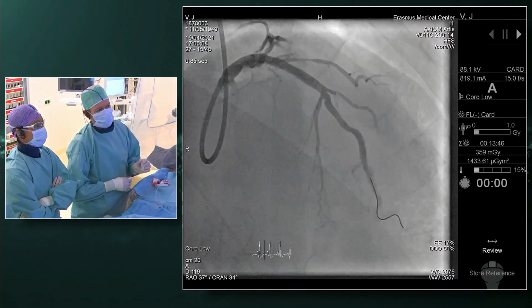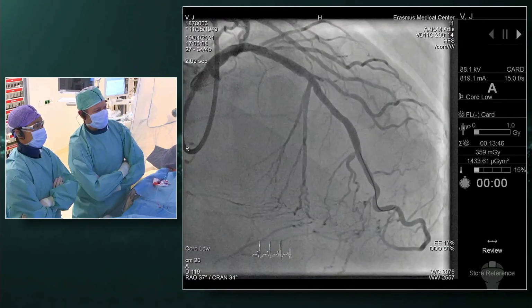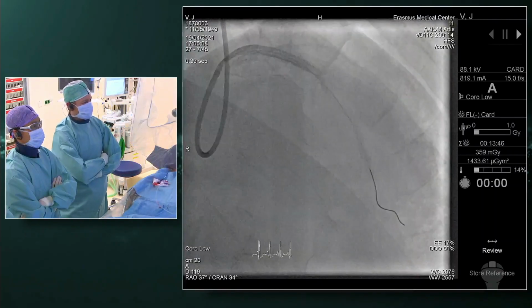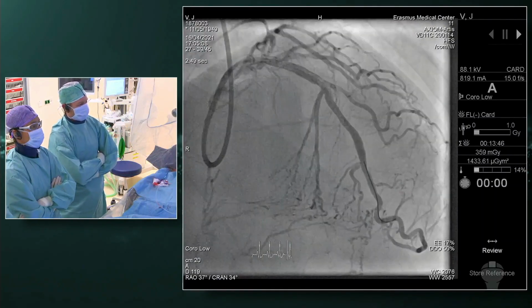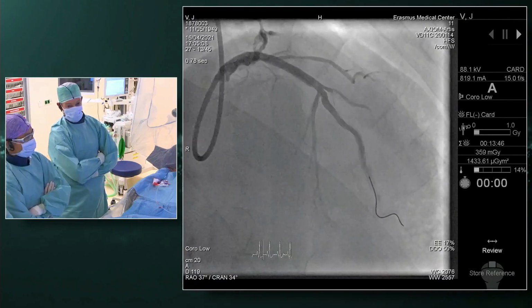Now it's fine, the patient is fine. Here it is. Yeah, just here it is. But so I think I'm pretty happy. We'll continue with the circ. Yeah. And we truly hope we gave you a good impression of what the orbital can add.